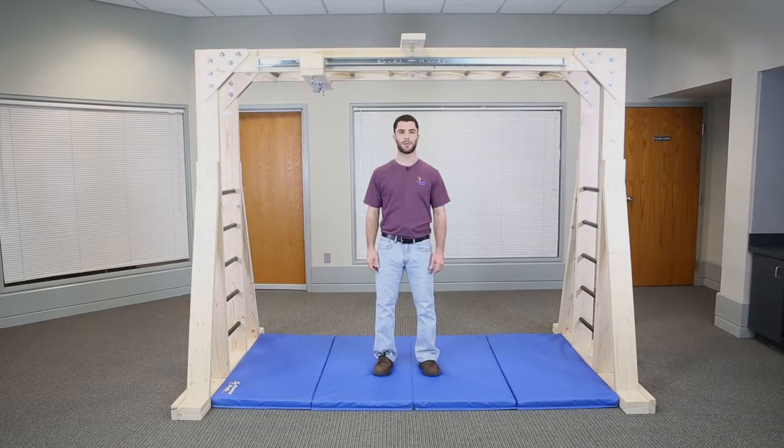Hello, I'm Cameron with eSpecial Needs, and I'm here to show you how to install one of our indoor therapy gyms. All of our gyms require a flat and level surface for installation and range in length from 9.5 to 13.5 feet long. All gyms are 5 feet wide and 8.5 feet tall.